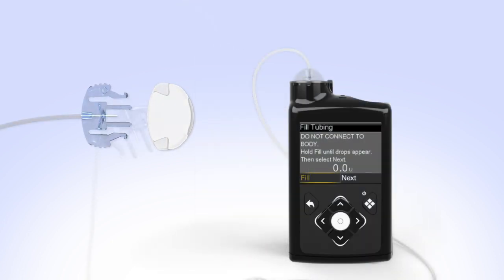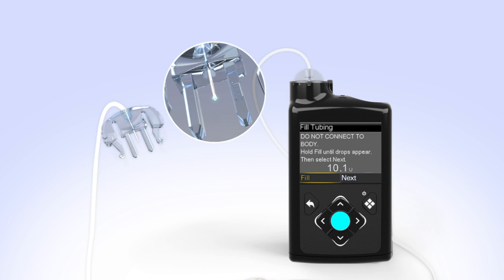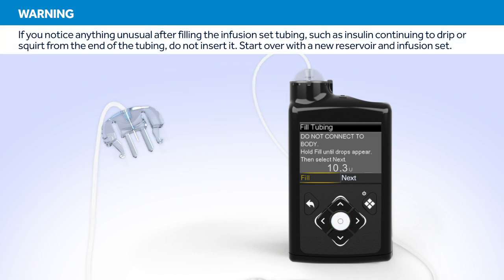Remove the white cap from the infusion set. Hold the set so that the needle is pointing down. With Fill highlighted on the screen, press and hold Select. The pump screen will display the amount of insulin being moved through the tubing. Continue to hold Select until you see insulin drops coming out at the end of the needle. After you see the drops, release the Select button. Hold up the tubing to the light to check for air in the tubing. If you see air, once again press and hold Select until the air exits the end of the tubing.